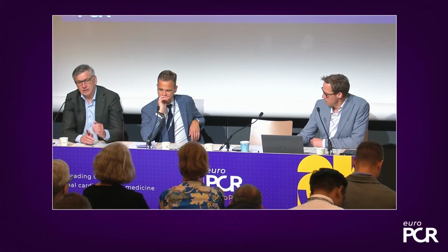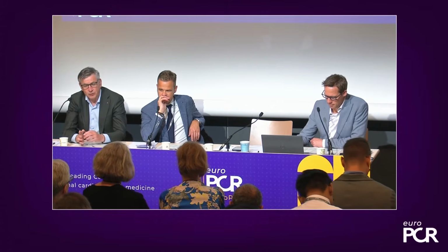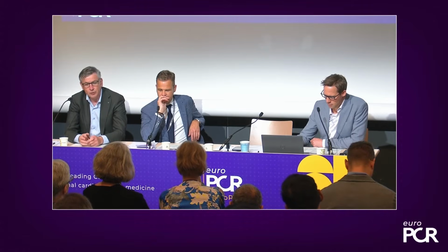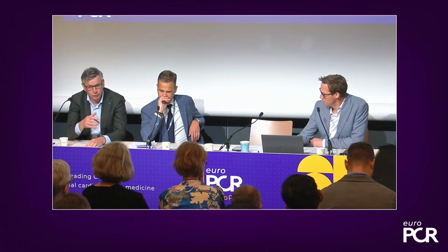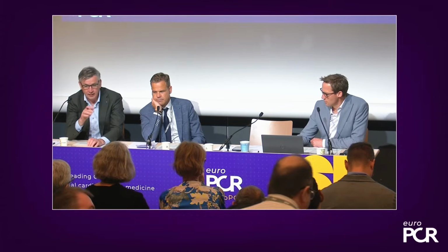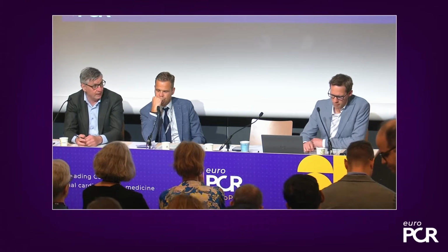No, I mean, again, it's all the normal things. If you have a high quality CT scan, you need to have contrast filling at the right time. You need to be in the left side of the heart, of course. You need to avoid patient motion, and you need to have high resolution. So often what we do is use the same protocol as we use for patients with aortic stenosis going for TAVI. It's ECG gated, it's got sub 1 millimeter slice thickness and timing of the contrast, and I think that is going to give you really nice images.